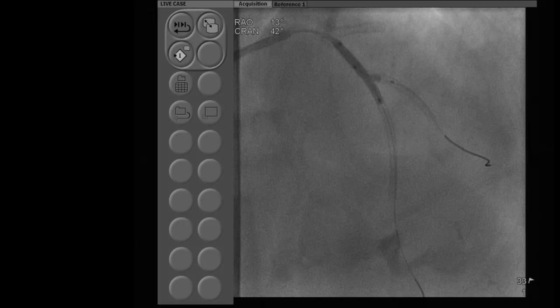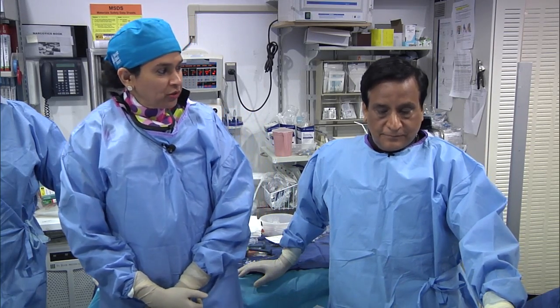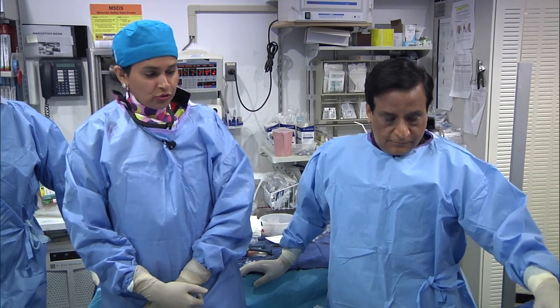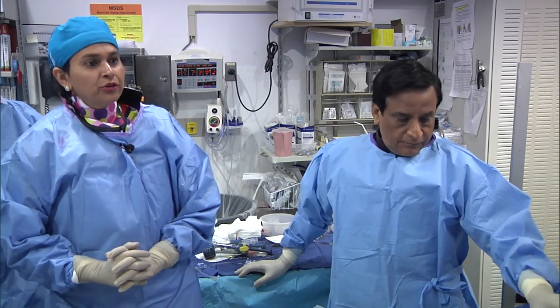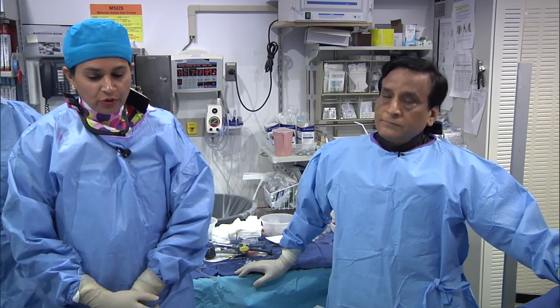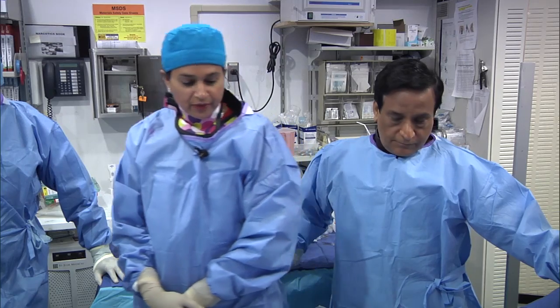Excellent, Samin. Anu, take home message from you. I think whoever is trying to use BVS should not be doing this kind of complex case in the beginning. I would say just get used to doing simple straightforward cases. Even if it's calcified, try to do single stent cases. Learn how this technology works before you go to this kind of complex case that we just showed.